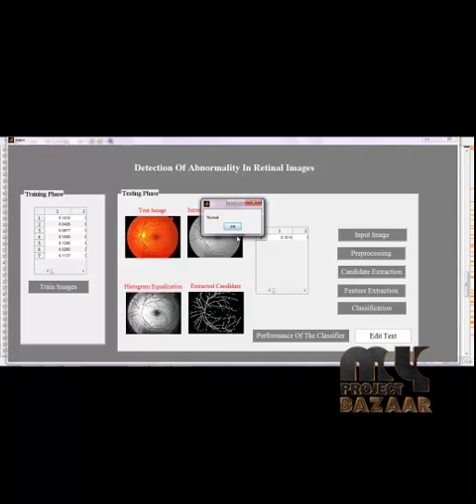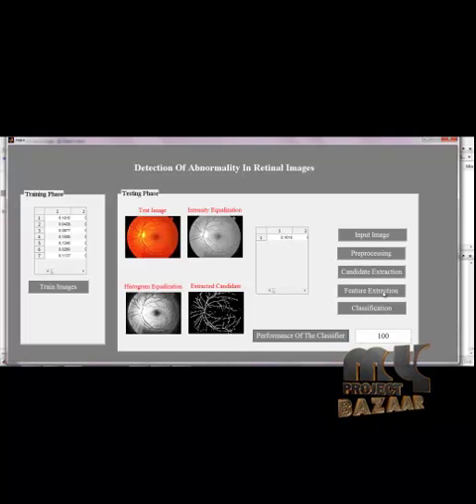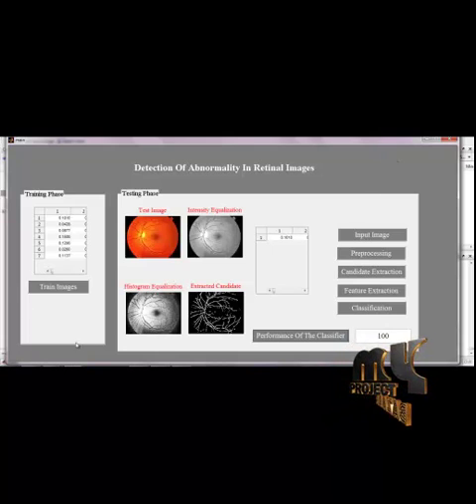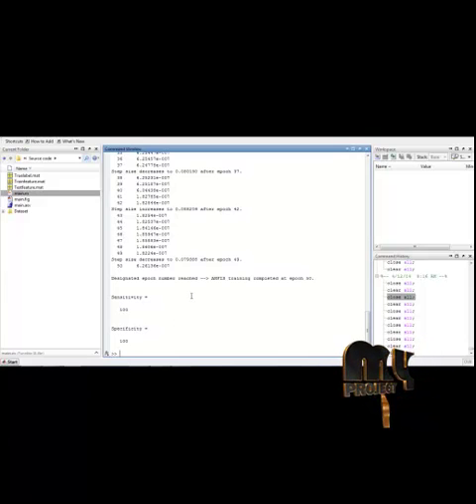The normal, moderate, and beginning levels were classified, and then we are measuring the performance of our classifier. The performance of our classifier is measured, and the result will be displayed here. Since we have all the images trained, the result is 100, and also we are calculating the sensitivity and specificity, so the accuracy, sensitivity and specificity of the overall performance. Thank you.